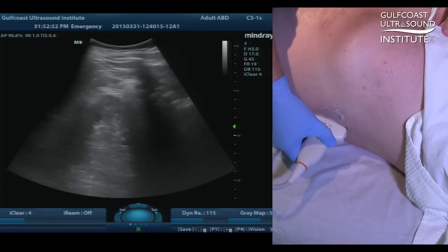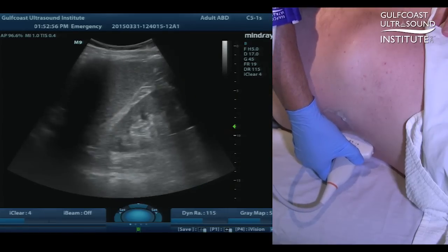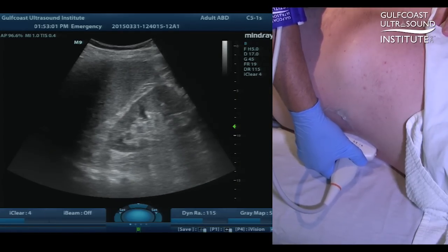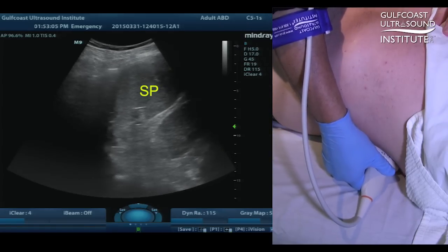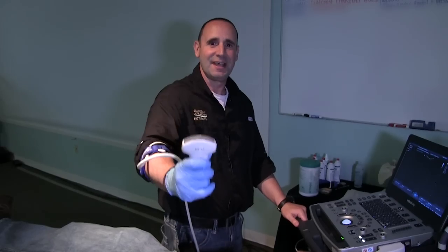So I'm going to show you one more time. Touch the left side of the body, place your hand on the bed. You see the kidney come into frame and go up toward the head, and there you have the spleen in the sagittal plane. And now you give it a try.